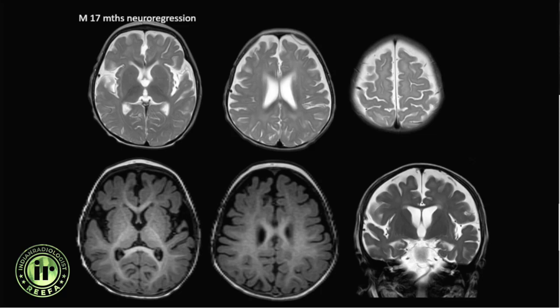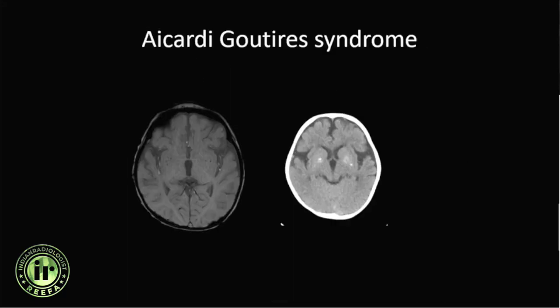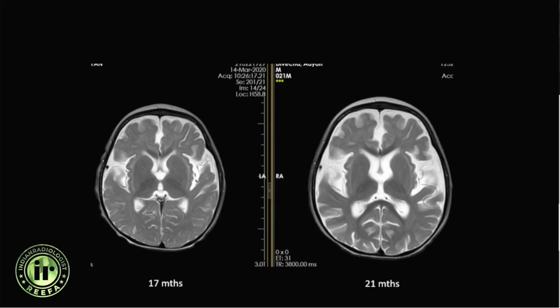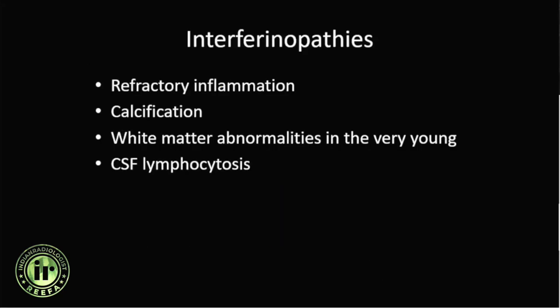A 17-month-old with neuroregression showed diffuse white matter volume loss and signal abnormality in the white matter, but no other specific MRI findings. On SWI and CT, there were tiny specks of calcification in the basal ganglia, confirming the diagnosis of Aicardi-Goutières syndrome. On serial MRI, progressive reduction in white matter volume was seen. Aicardi-Goutières syndrome falls under the classification of infantile interferonopathies, characterized by sterile inflammation, calcification, white matter abnormalities in the very young, and CSF lymphocytosis.